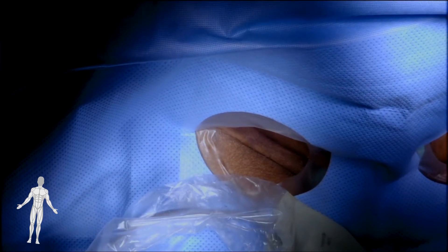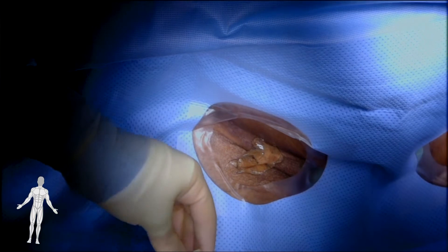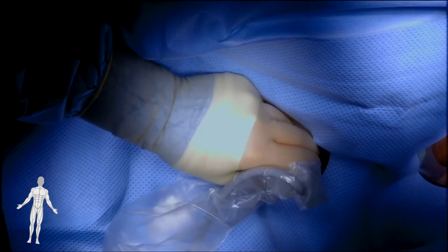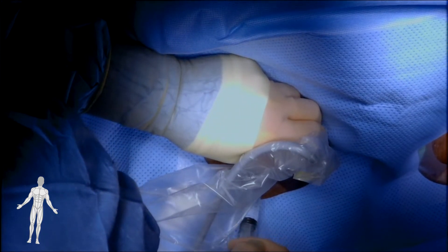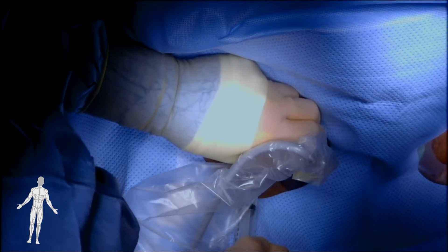The patient is prepped and draped in standard sterile fashion. The plan is to perform a left leg arteriogram with contralateral access. Care is taken to prep the left groin also in case such access becomes necessary during the procedure. This procedure is typically performed under monitored sedation. Here we see the surgeon giving local infiltration with lidocaine and epinephrine for analgesia at the access site.